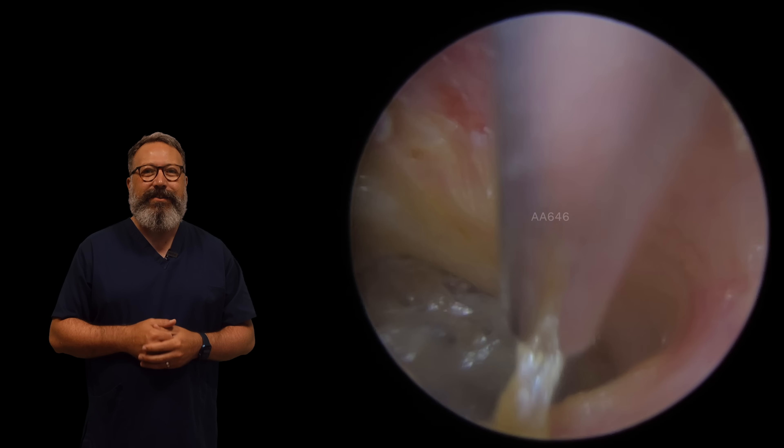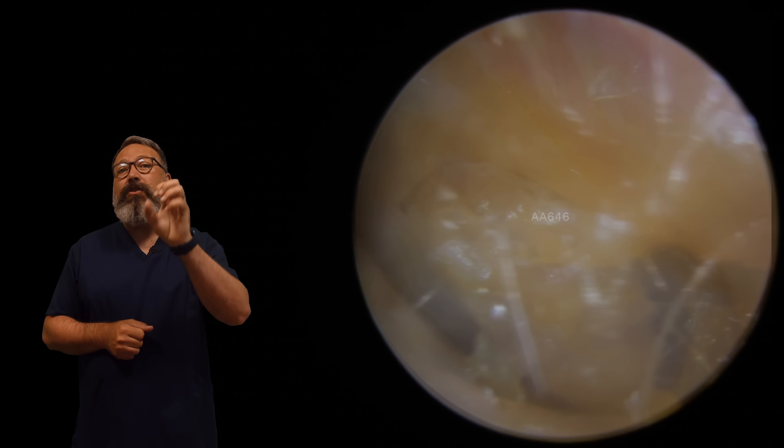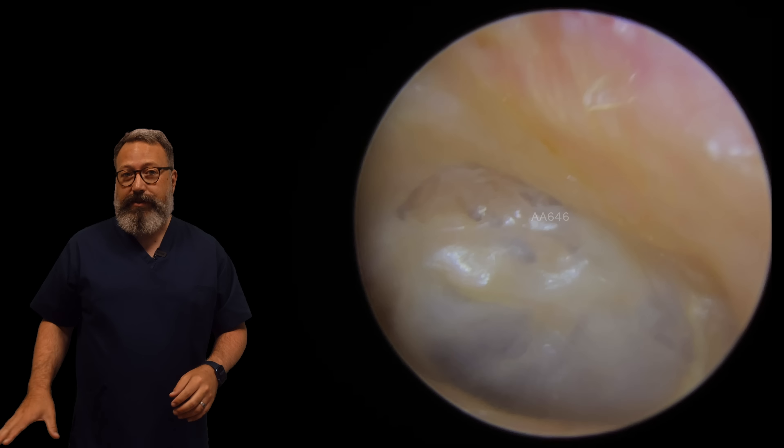We'll drop down to a fine end and just lift this up and get rid of it. You can see the eardrum on this side - lots of scar tissue there as well. This is what it looks like to start with, and this is what it looks like afterwards.